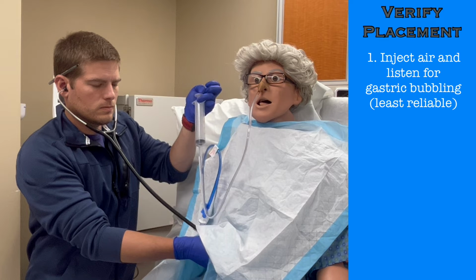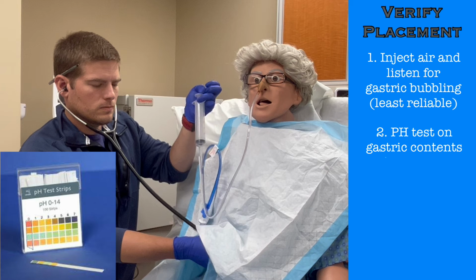If you have the supplies, you can perform a pH on the gastric fluid. Pull back on the syringe to remove some gastric fluid, then apply the fluid to a pH strip. A pH of less than 5 is indicative of proper placement. At Trinity Livonia, this method is rarely, if ever, used.